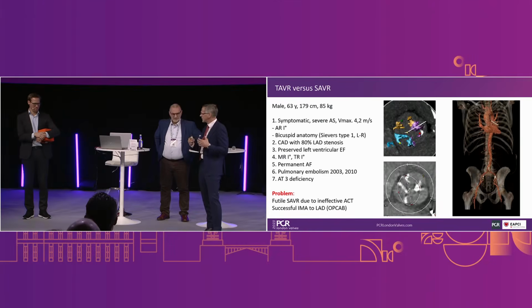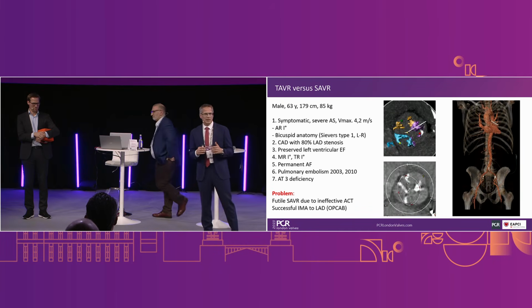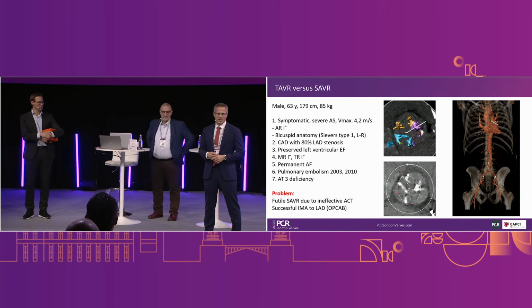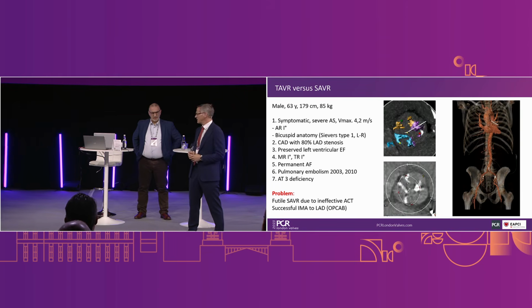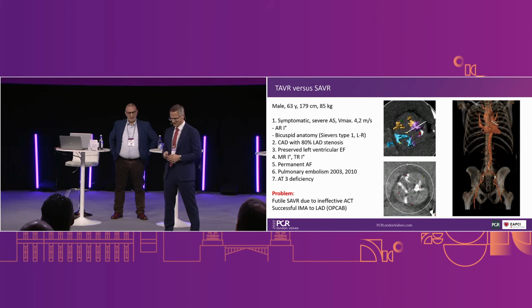So Tobias, if the surgeons couldn't get a therapeutic ACT, how did you get a therapeutic ACT? Just change the vial of heparin? No. Like you may have seen, we did some more diagnostics and we were able to see this antithrombin deficiency. So in advance, we were able to correct this issue, and we had a plan with our hemostasiologists and were able to get an effective ACT. Lovely.